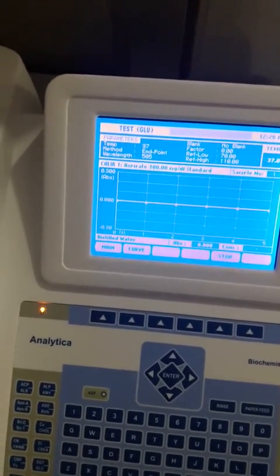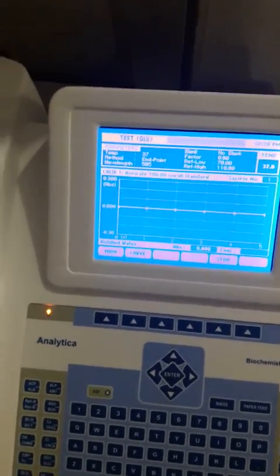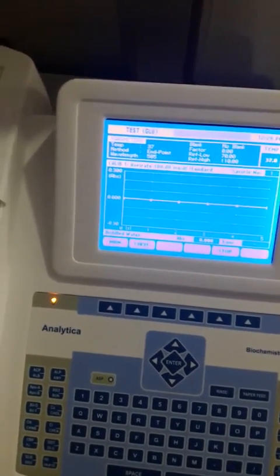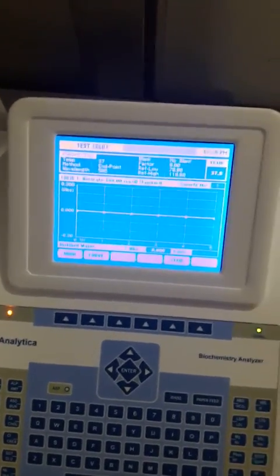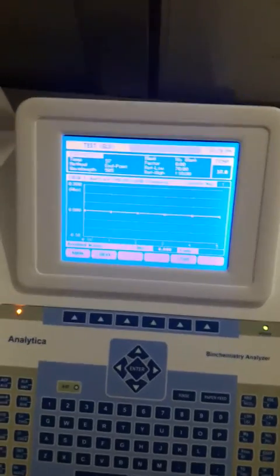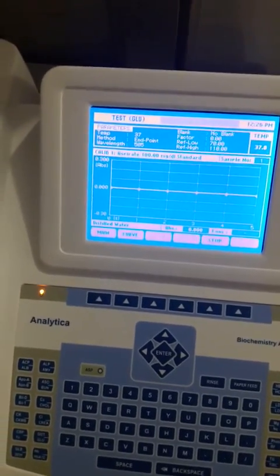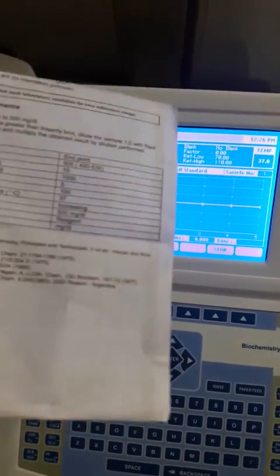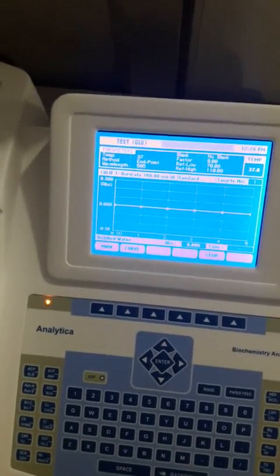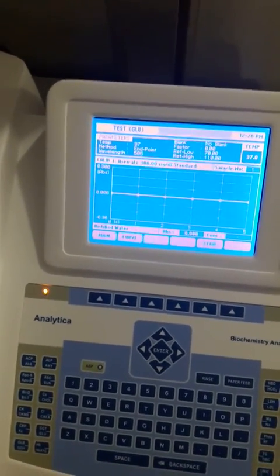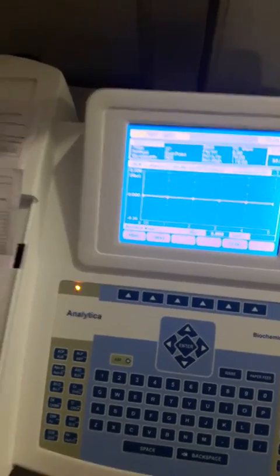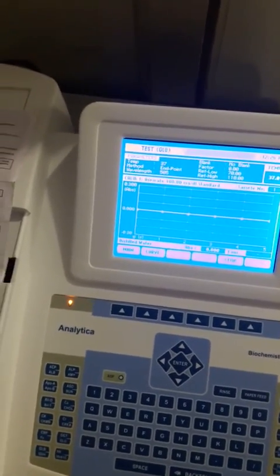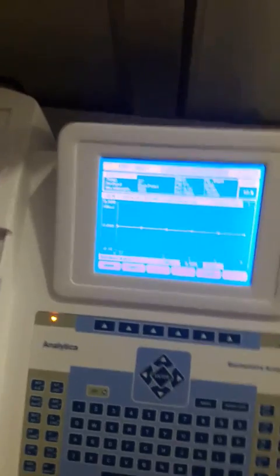The same procedure applies — the reagent with the blood serum sample. We mix that and incubate it for 10 minutes as per the literature. We have to incubate for 10 minutes before performing the test. Now we will mix the standard and the reagent, and also the sample with the reagent.